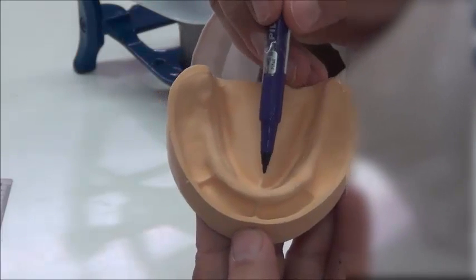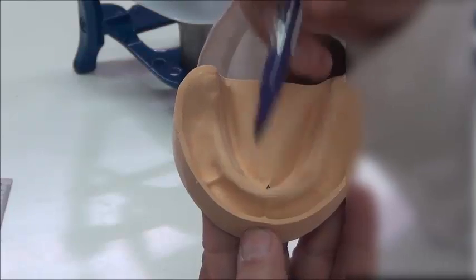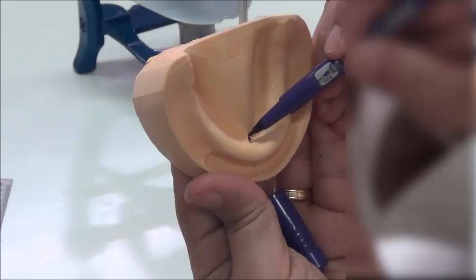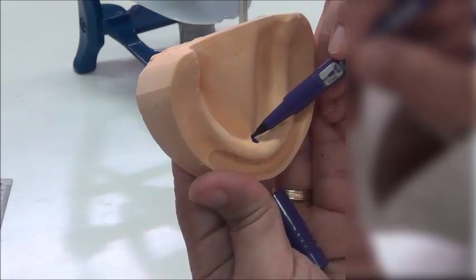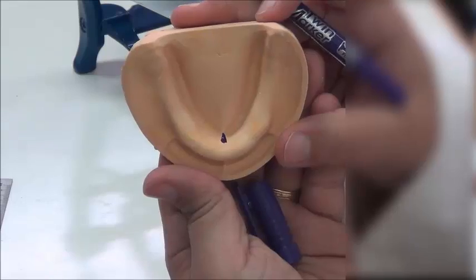And this is the genial tubercle, from which the lingual frenum erupts and goes out. So my line comes from inside, from the lingual frenum. This is the most anatomical structure indicating the midline. So it's around this area.